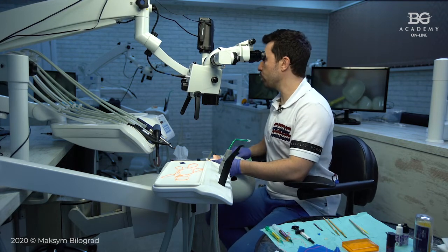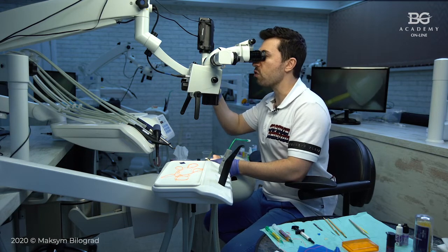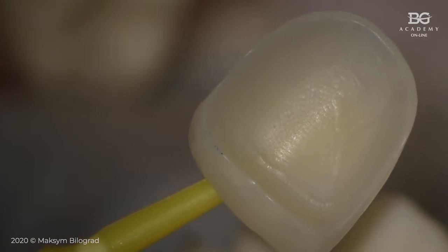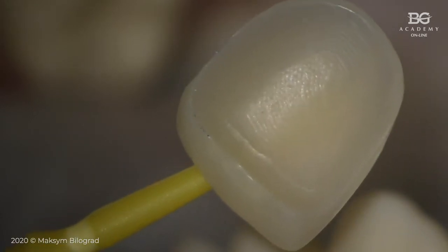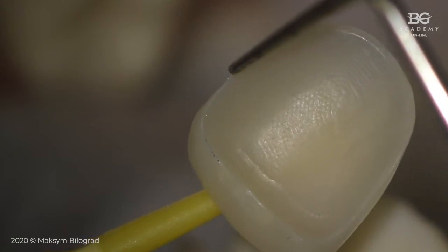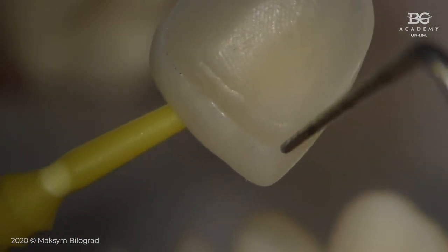Before you etch a ceramic veneer or crown or overlay, doesn't matter, with hydrofluoric acid, you have to check, really important thing, that there is no glaze here on the peripheral part of the ceramic.